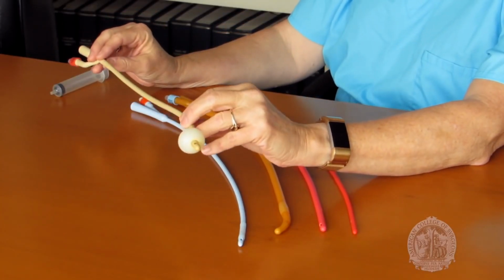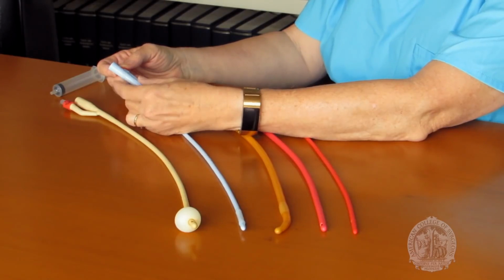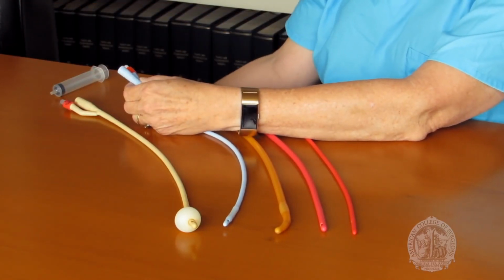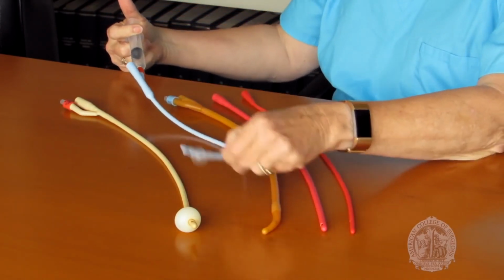It comes in various sizes, measured using the French system. On the internal end, it has a balloon to ensure that it stays in place. On the external end, it has two branches. One drains the urine into the collection system. It's connected to some tubing and then to usually a bag, while the other is used to fill the balloon with sterile water. We would put it in here like this and blow up the balloon. Be sure to check the number on the ring at the end of the catheter, because that will tell you how much volume to use when filling the balloon.